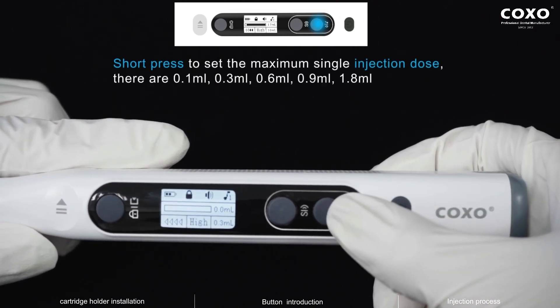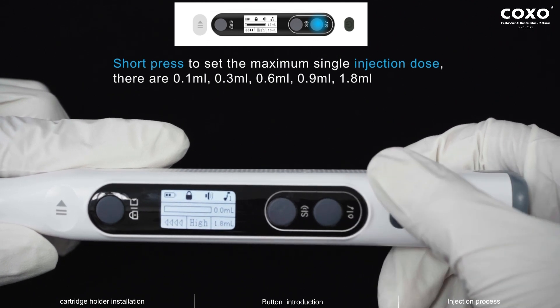Short press to set the maximum single injection dose. There are 0.1 milliliter, 0.3 milliliter, 0.6 milliliter, 0.9 milliliter, and 1.8 milliliter.